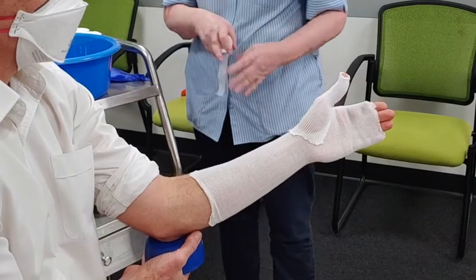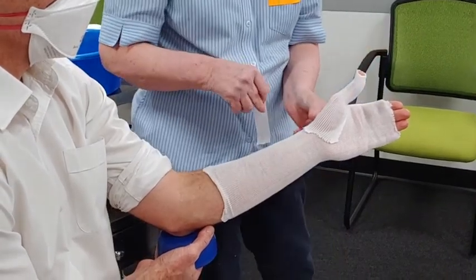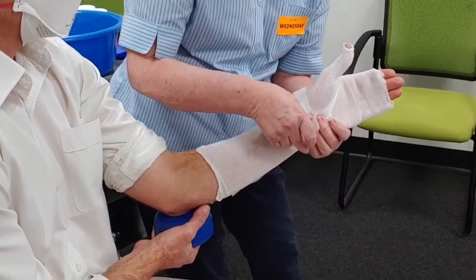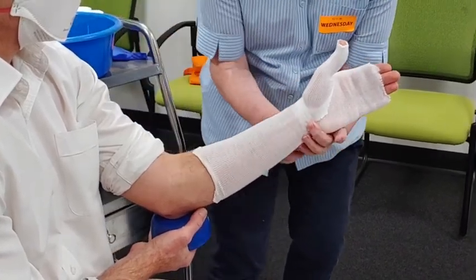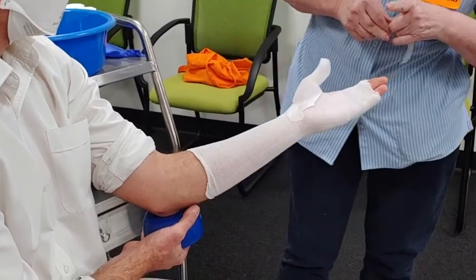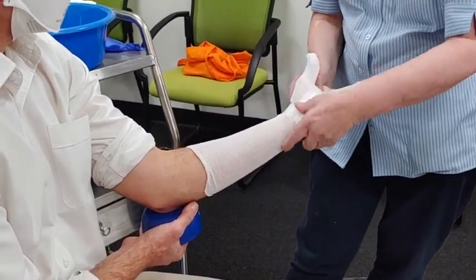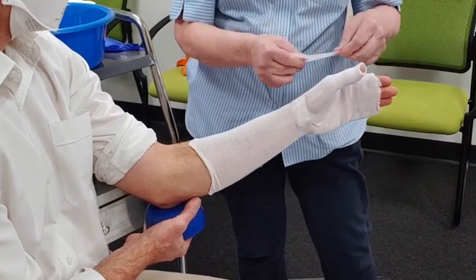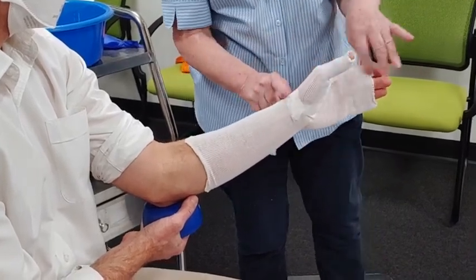We take our tape, splay that out at the bottom, bring it round, and apply another piece — just making sure that all the skin is actually covered. So that's ready to go.